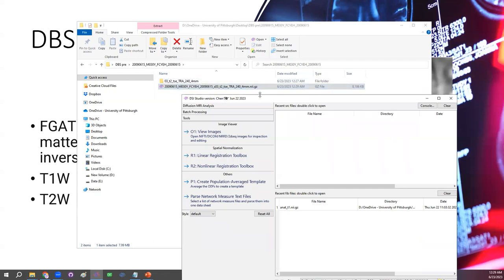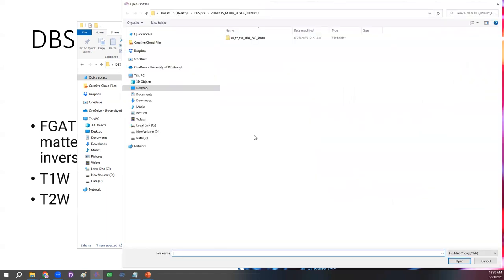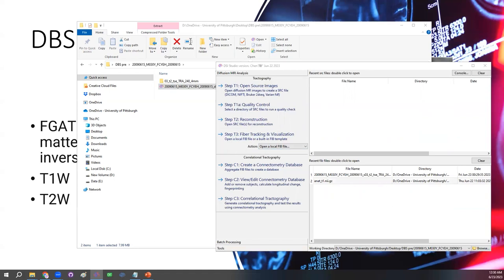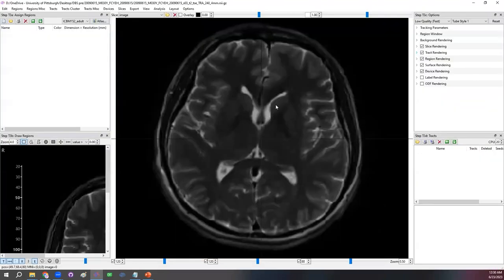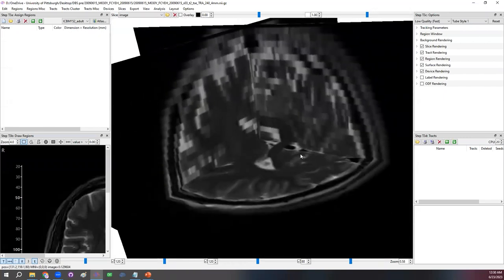Once we have created the NIfTI file, we can open it under the Diffusion MRI Analysis tab. We don't really need DWI data — we can jump straight to step T3 using the visualization interface. Click on it and select the file. The default file extension is a DWI-generated FIB file, so change it to NIfTI so the NIfTI file we created shows up, then open it. The image is T2 only, and the axial direction resolution is lower, but that's okay — we can still use this as an example.